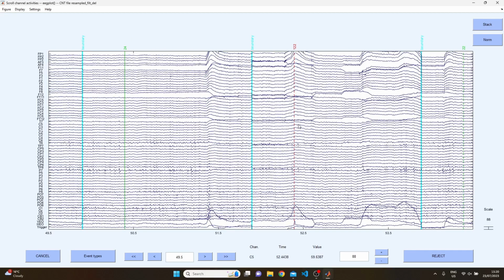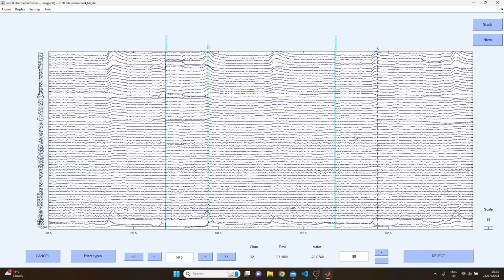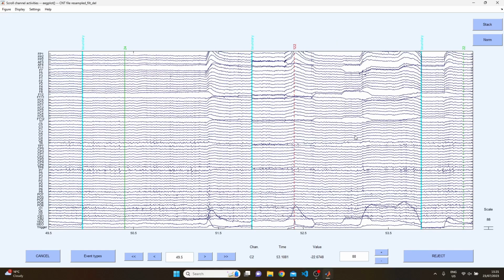To reject a period of data, click and drag, and to deselect the data, click on the highlighted section. This click to deselect function can be quite annoying because if you want to delete a continuous stretch of data, you'll want to join the chunks of highlighted segments up, and unless you do this carefully, it's very easy to deselect the previous chunk. To scroll, press the left and right arrows.